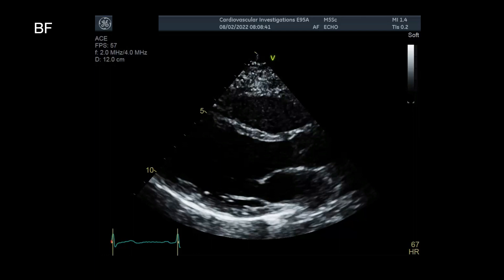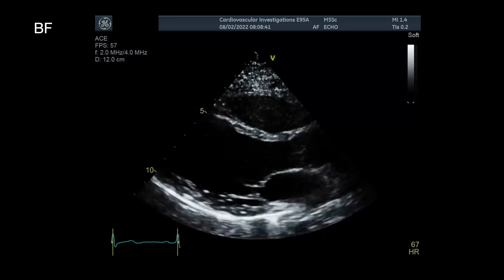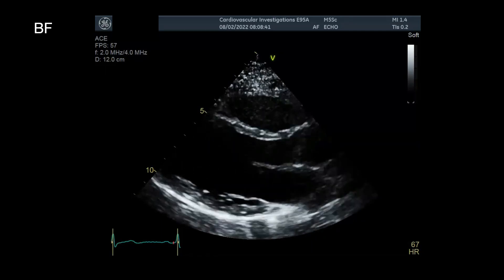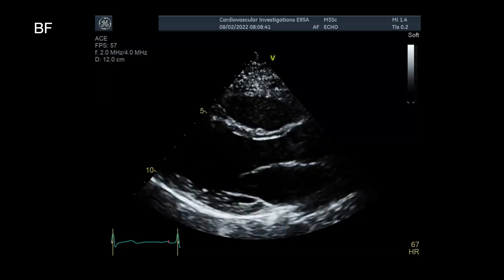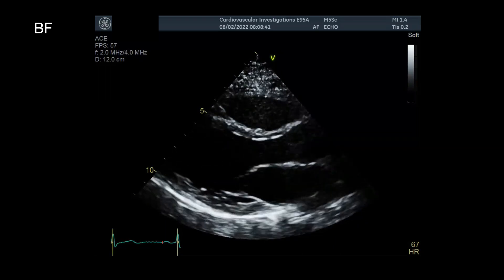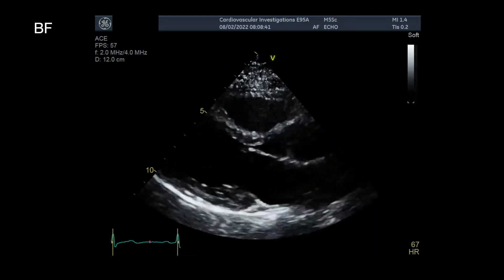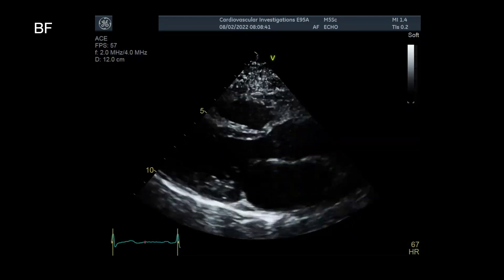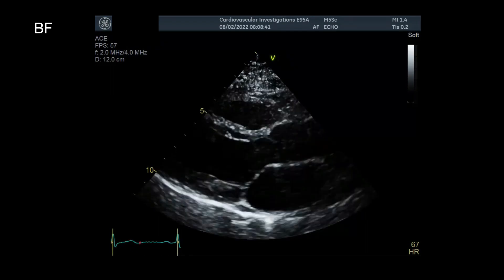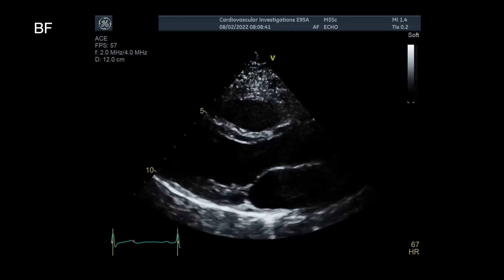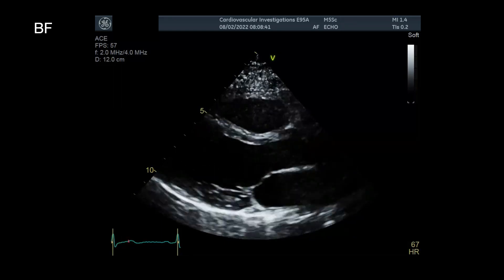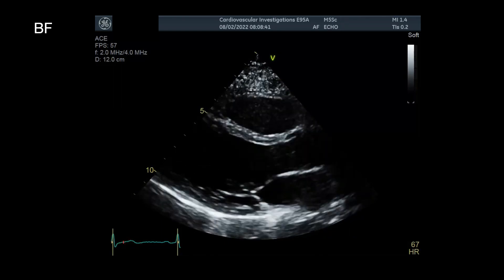Let's look at some examples, starting with a normal echo. This patient has normal LV and RV function. In the parasternal long axis view, we can see the RV at the top of the screen — it doesn't look enlarged. The LV looks to be contracting normally, and there's no grossly obvious valvular abnormality.